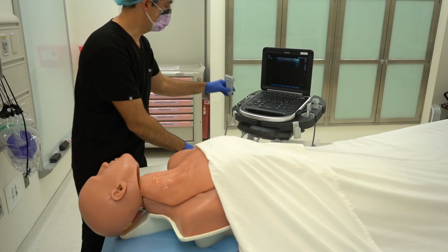Now, before we proceed any further, we'll do our timeout, where we confirm the name of our patient, the date of birth, the procedure we're doing, the laterality, and the allergies of any potential medications that we might be giving.